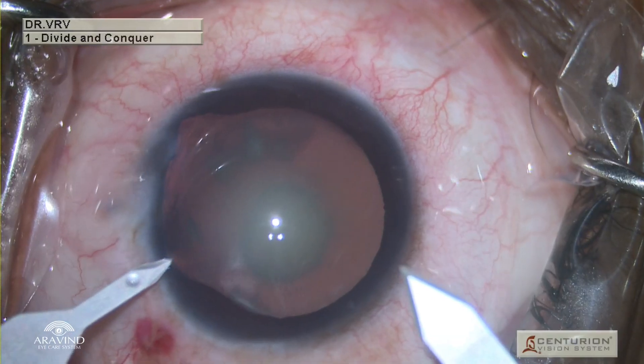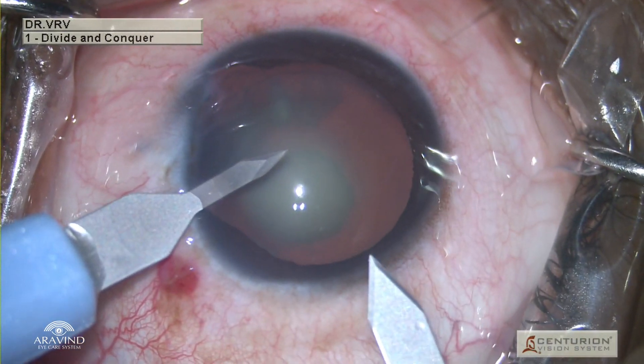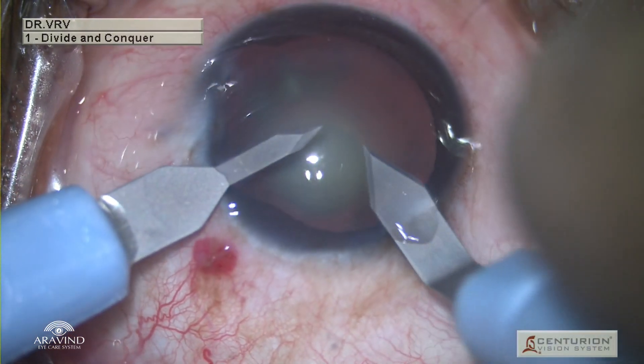First, using a 1 mm keratome, the secondary incision is made at 5 o'clock position. The globe is stabilized with the blade and with the help of a 2.2 mm keratome, the primary incision is made.